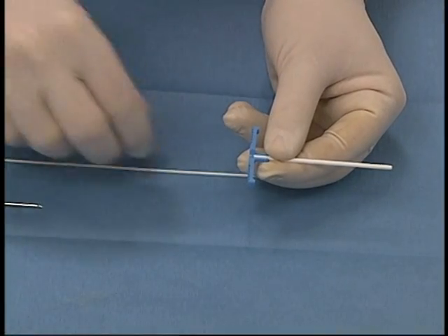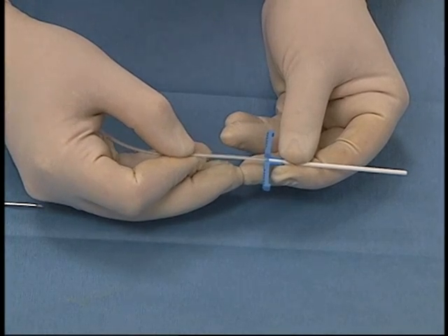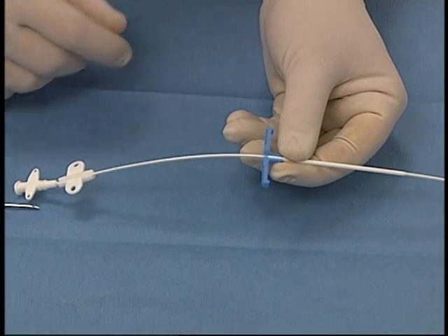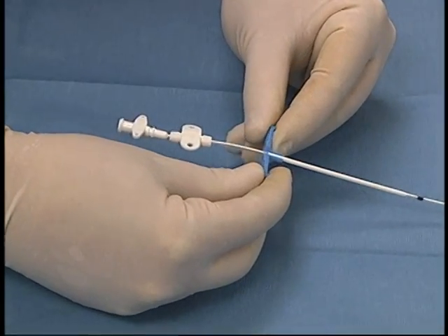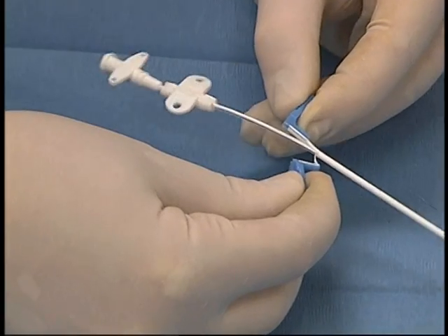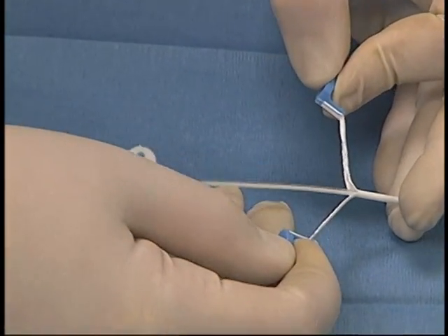A peel-away sheath with a stylet is inserted into the vessel. The stylet is removed and the catheter is inserted through the peel-away sheath. The catheter will be inserted to a pre-measured level. Once it has reached that level, the peel-away sheath is snapped and gently peeled off the catheter, while at the same time the catheter is inserted more completely into the vessel.